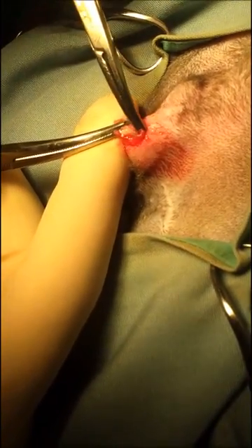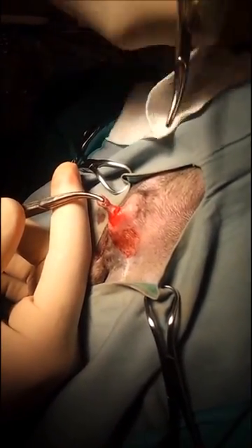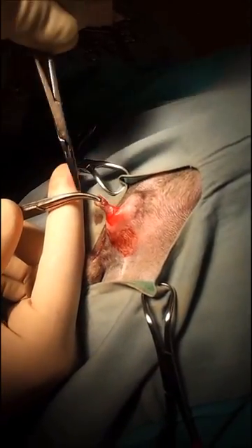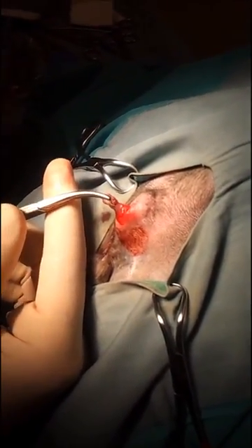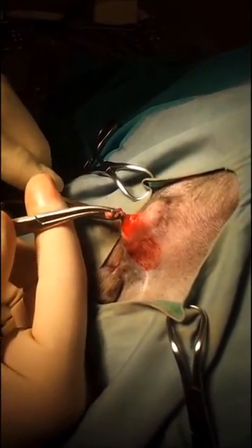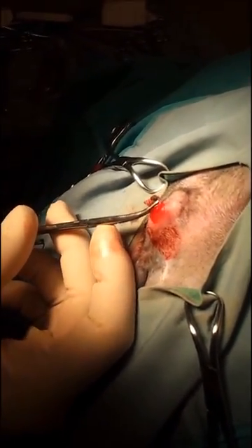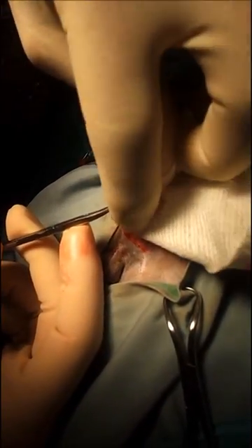You can even undermine like this. Sometimes it's better to use a hemostat so you can get in there and undermine that overlying tissue. Also, what I've done that I didn't mention is I've emptied the anal glands before doing this procedure to minimize any contamination.